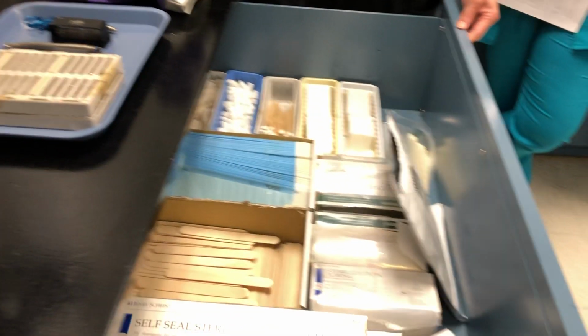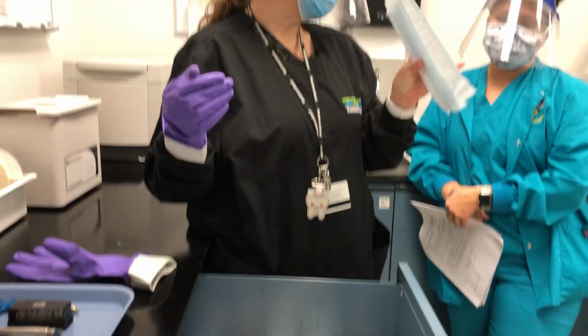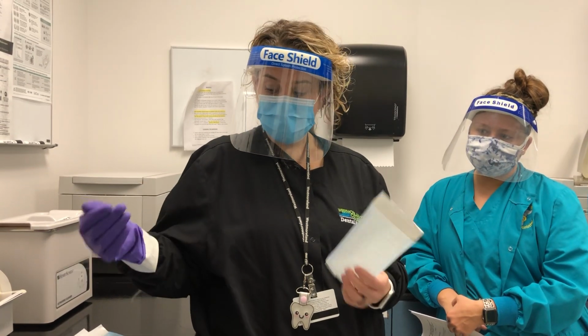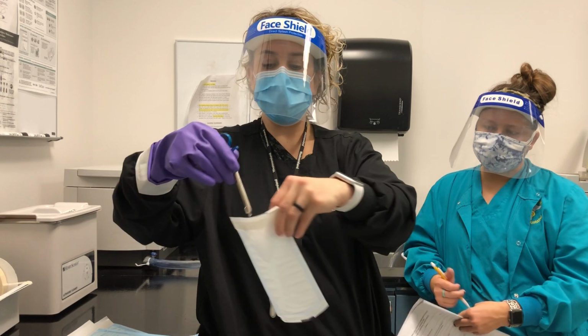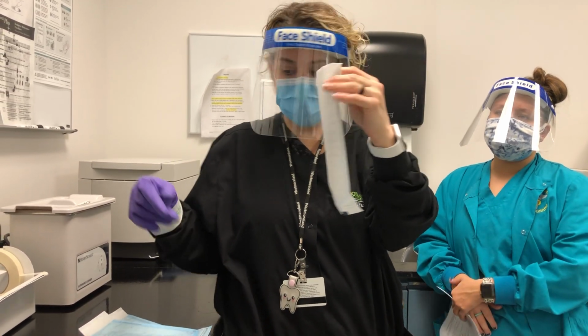You're going to open your drawer. And then we're going to work with the same pouches. So by the time we're finished, they'll be all wrinkly and ugly, but it's okay. We're just doing it for practice. But each one is going to hold one of our items, okay? So I can pick this up with my purple glove, okay? And you're gonna just drop it down in without touching your hand, okay? And you can just do it like that.